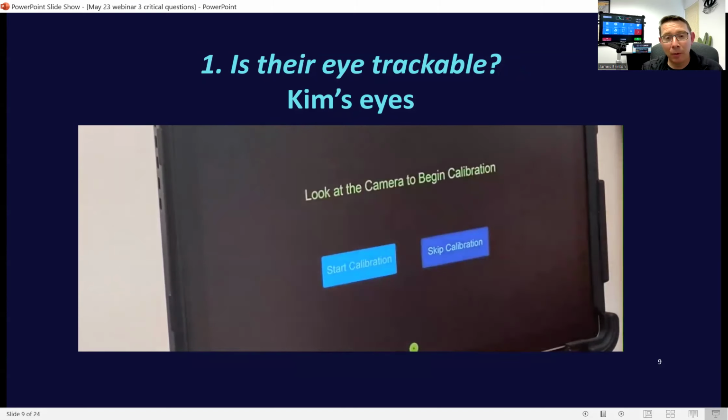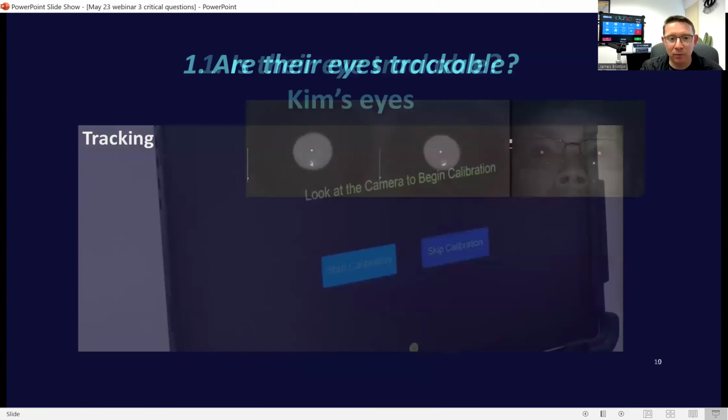And then we can go into calibration. As a reminder, we need to get their body comfortably supported and comfortable. We bring the device to them, we point the camera right at their eyes, focus that image, and then we can see that visible tracking indicator to launch right into the calibration screen. Setting the stage to calibration in this manner gives people a quick and effortless access to calibration and then an accurate experience. So these are the steps we go through to set them up for success. Let's continue.